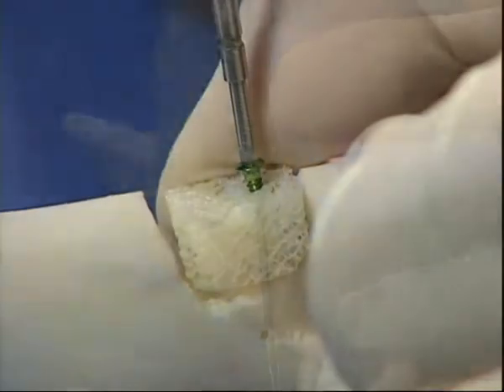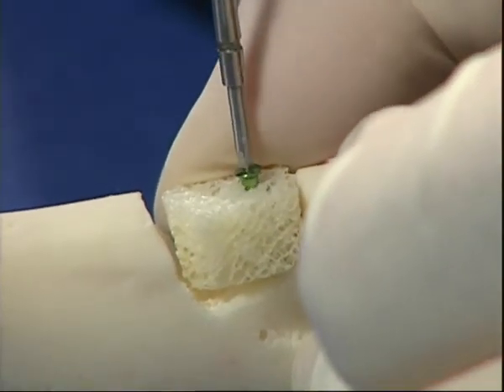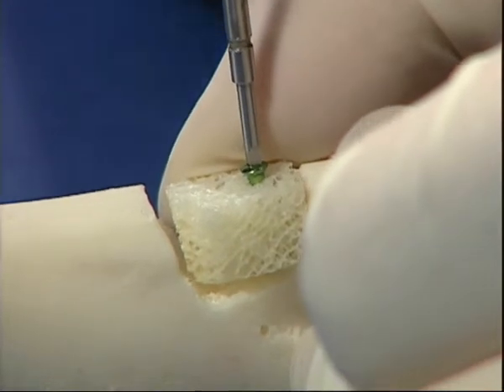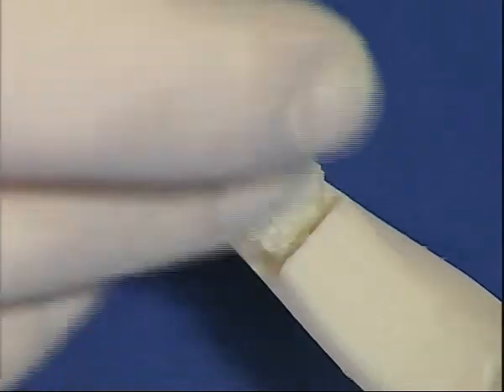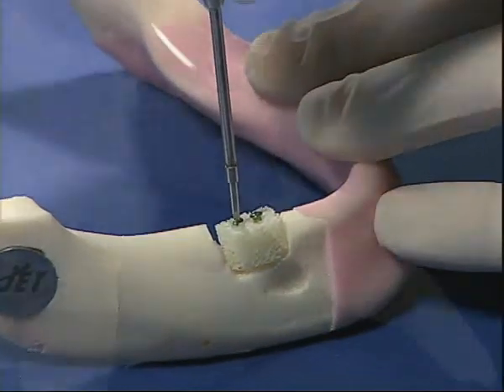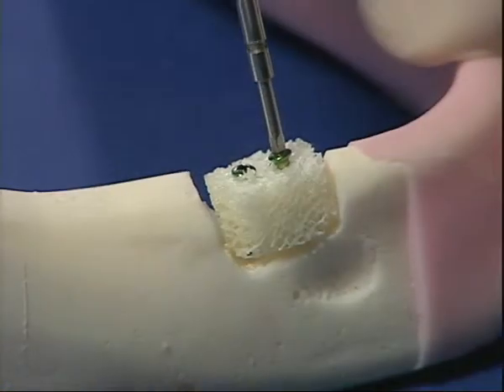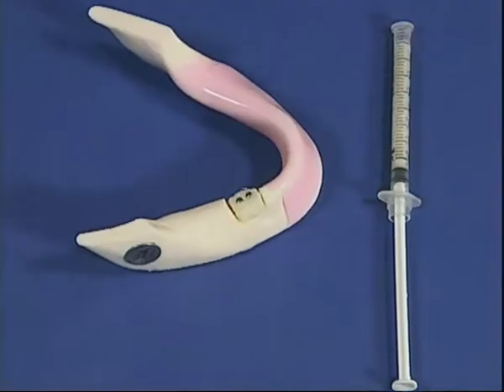So, it is necessary to fix the graft using a screw. The material can be easily perforated. To guarantee primary stability, it is necessary to fix a second screw as well. We call this process primary stability because it is the first stability we give the graft. There is also a secondary stability which is given by the newly formed bone in the cavity.